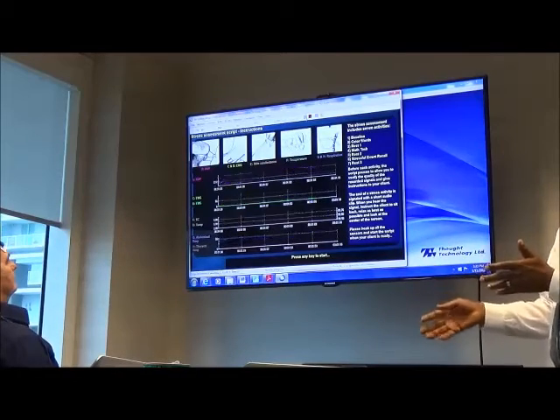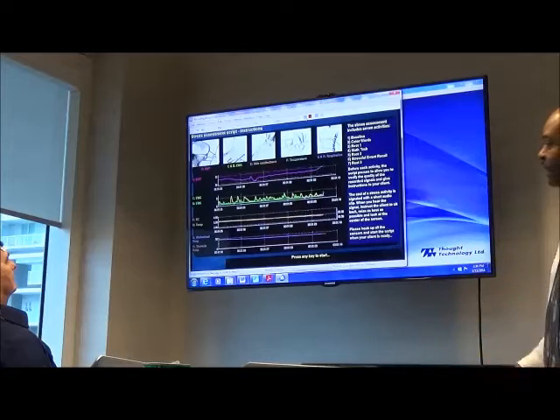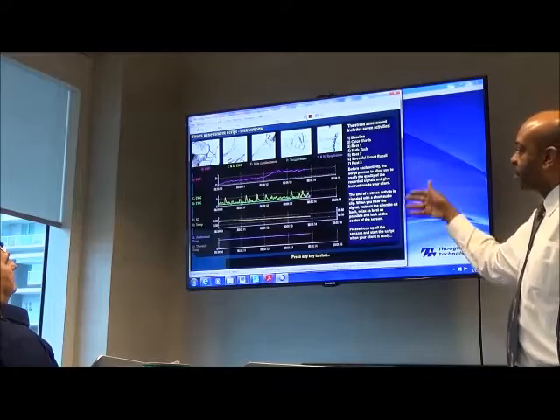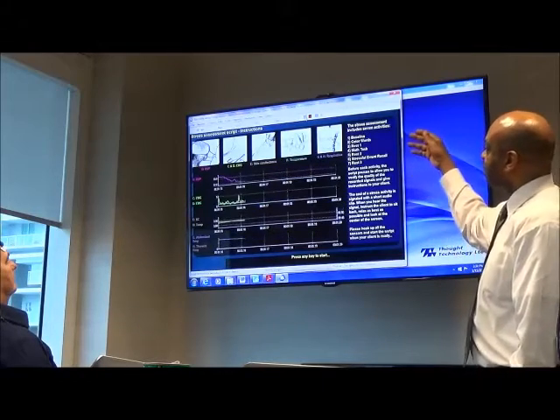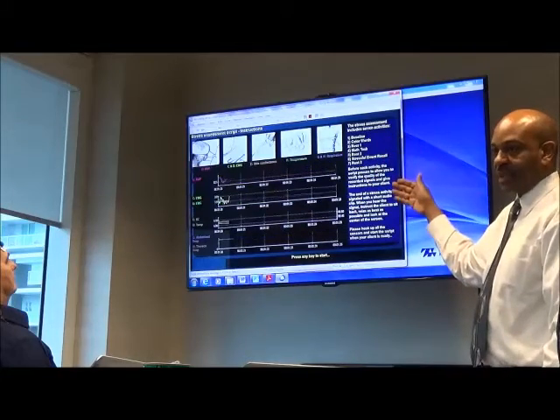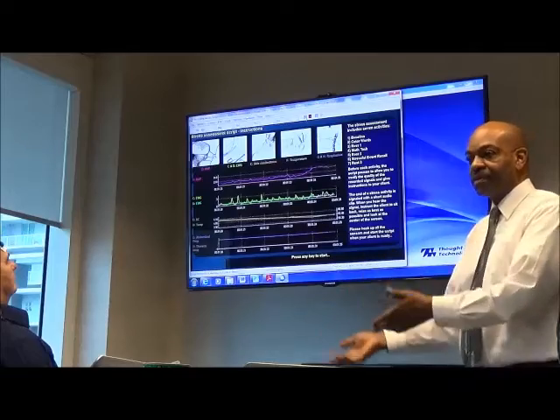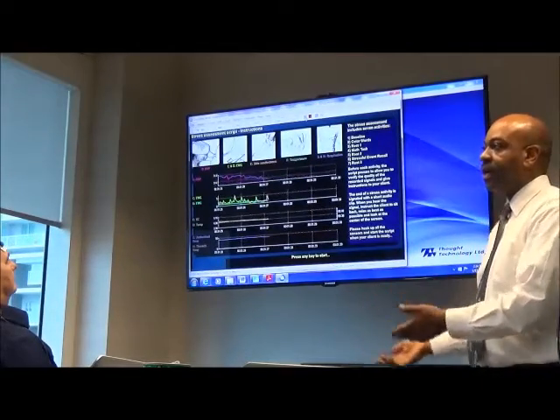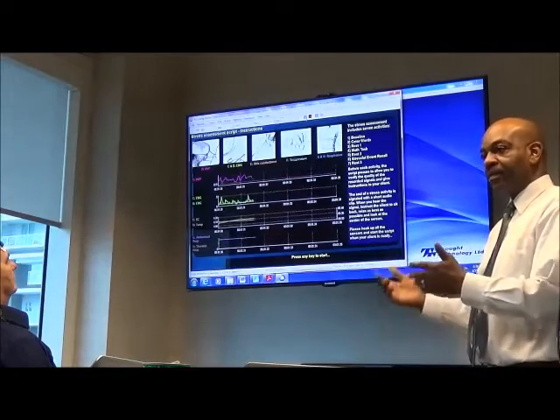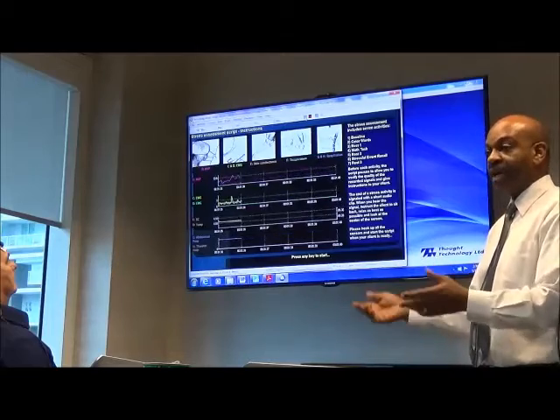Do they look comfortable, or do they look uncomfortable because of something that you could fix? So this is showing you an outline of what's going to happen in the stress assessment. I would usually go over not all of these details right now with the person, but I would be explaining to them before we started, I'm going to put some sensors on. It's going to be measuring how your body reacts to stress. I would also explain to them that there's going to be times that I ask them to do a task and other times I ask them to relax quietly.